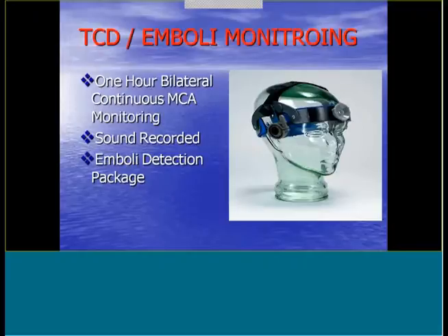It isn't something that you can hand the docs a piece of paper with a picture on it and say, you see that thing right there? That's an embolus. That doesn't work. And for you doctors that are interpreting these, you can't just look at a piece of paper and say, that might be one, I don't know, that might be one. You need to sit physically in front of the machine and play all of these back. So you need to look at it, you need to be able to see it, and you need to be able to hear it in order to accurately identify an embolus.